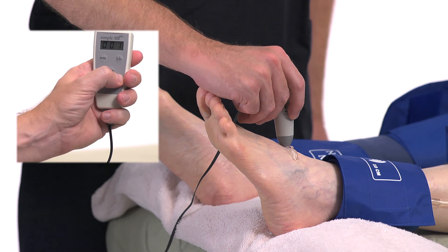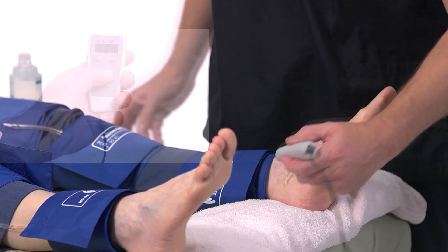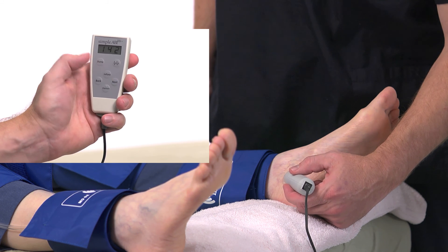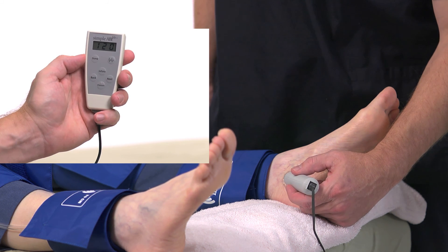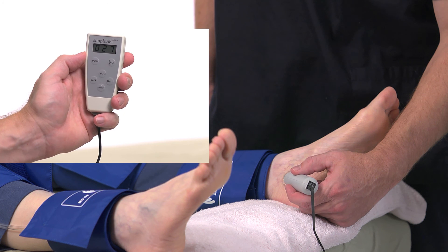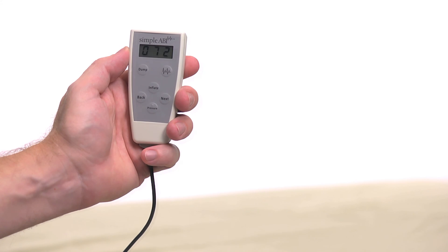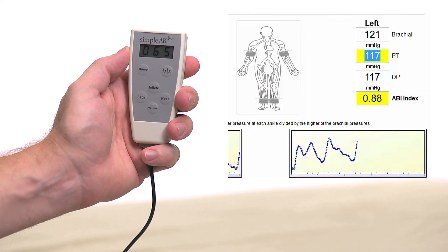Press Next to move to the left PT field. At the left PT, find a good Doppler signal. Press and hold Inflate until blood flow is occluded plus 20 millimeters. Release the Inflate button to begin deflation and press Pressure when blood flow returns. The left PT pressure will be entered in the left PT field. Press Dump to release the pressure in the cuff and prepare to take a PVR waveform. Obtain a PVR waveform at this ankle cuff by pressing the button with the waveform image on the remote. The cuff will inflate to the proper pressure and hold while the waveform is obtained. Pressing Dump or Next will release the pressure in the cuff.